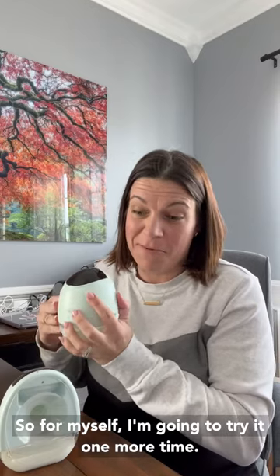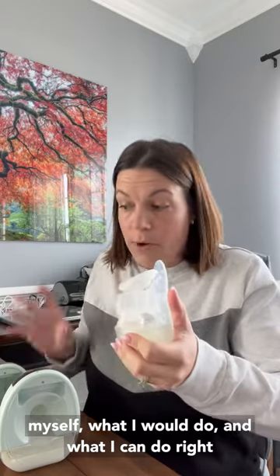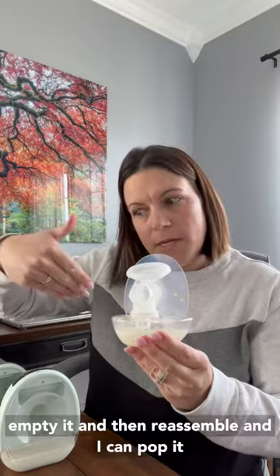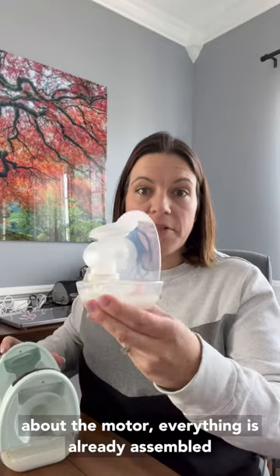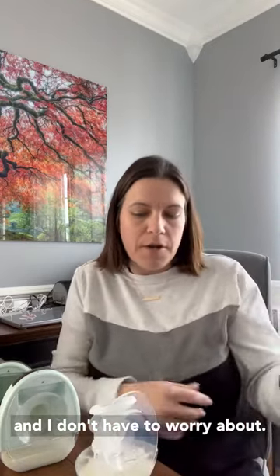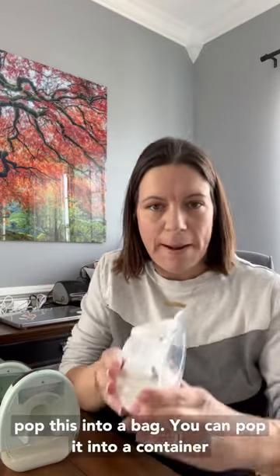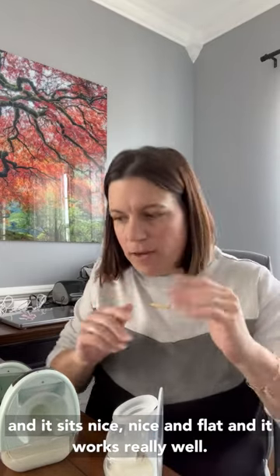For myself, what I can do is take this off, set it to the side, empty it, and then reassemble and pop it right into the fridge. I don't have to worry about the motor. Everything is already assembled. If it's sitting in your fridge and you're worried about it getting exposed or touching anything, you can just pop this into a bag or a container. It sits nice and flat and it works really well.